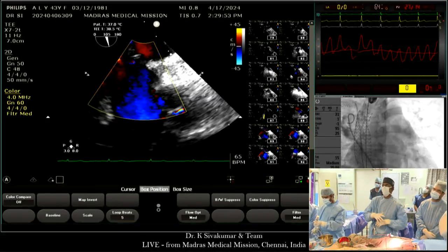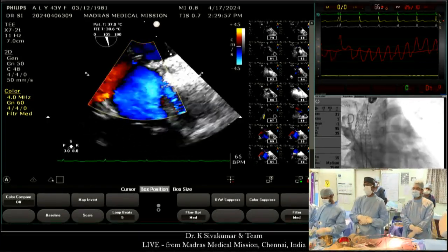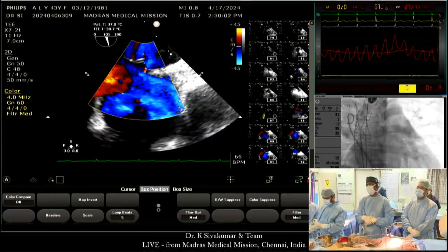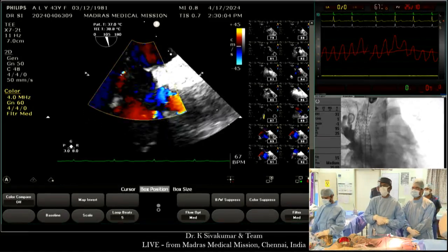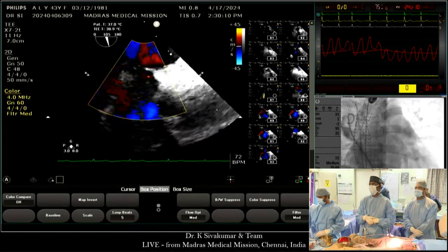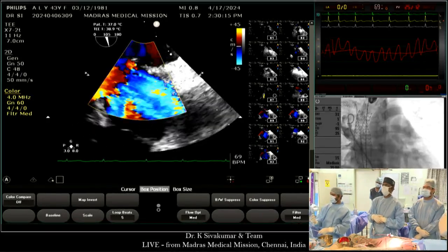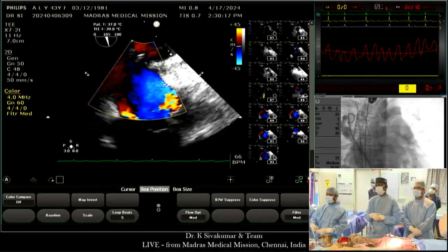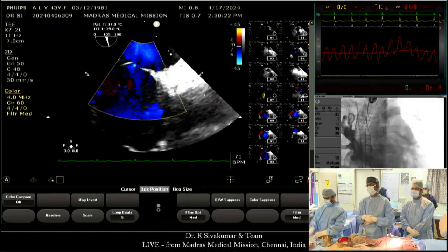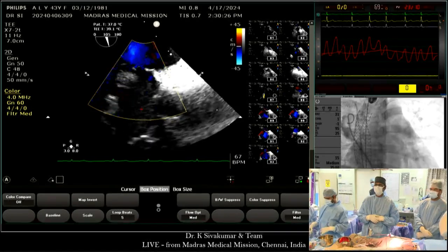All these years, the left ventricle was not getting fully filled because of the pre-tricuspid shunt, and suddenly now a reasonably elderly person is getting the full cardiac output going into it. Sivakumar, make sure to put this patient on some diuretics and afterload reduction. We will do that. But 16 is not very alarming, because this patient is on positive pressure ventilation now. Once I take her off the ventilator, there will probably be another 2 or 3 millimeters of further reduction. Can you show the stent part nicely?